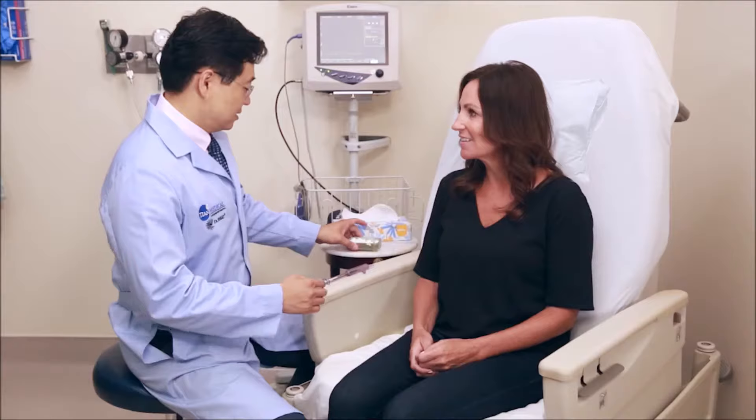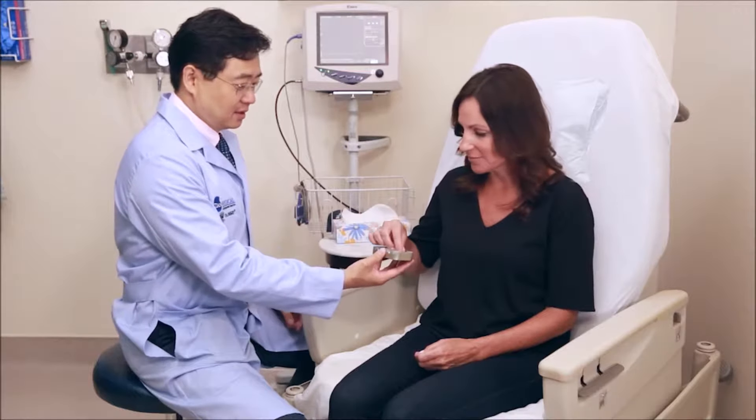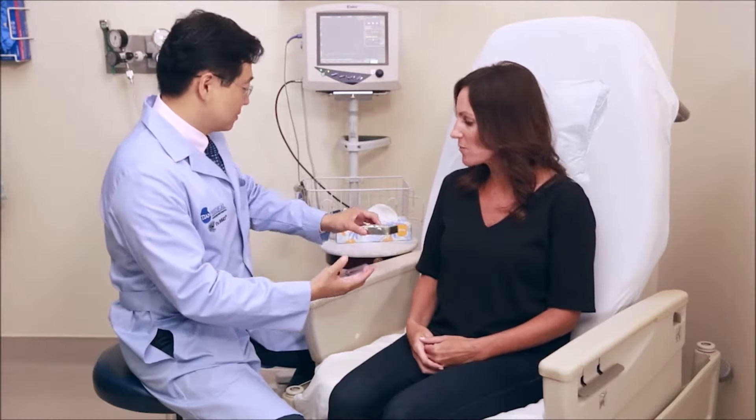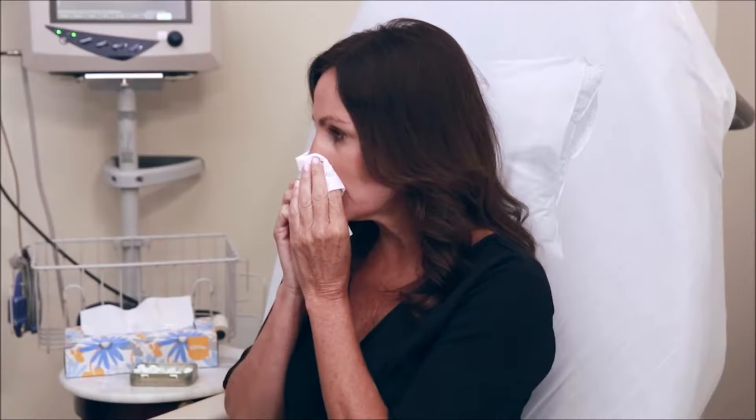Now we're ready to use the TX360 treatment system. The patient is now positioned properly with the mouth strip in place, and the patient has blown their nose to clear any nasal drainage.